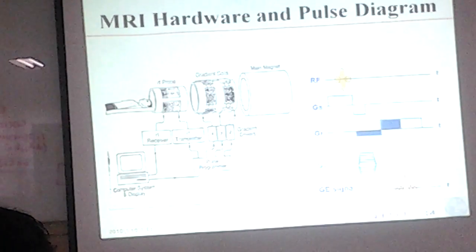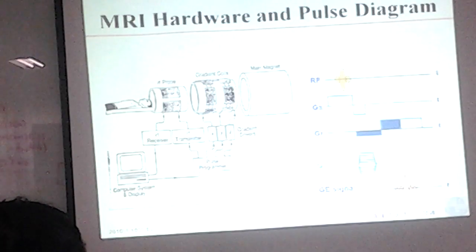These can determine which slice orientation it is: sagittal, coronal, or axial, by changing the axis of the gradient. So if we choose the selection gradient as, let's say, the Z gradient, then the image is an axial image. So I will explain about that later.